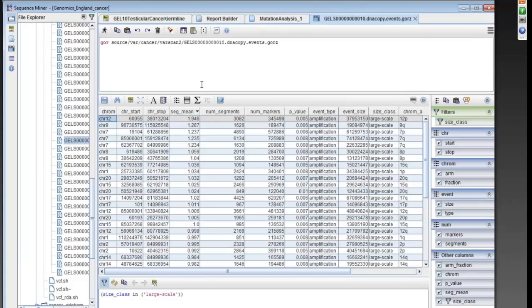Common NUT fusion is a NUT fusion with a bromodomain gene. In this case, we see a fusion between NUT and a kinase domain gene, CSNK1G3, which is a gene in the Wnt signaling pathway. So we see here a fusion between NUT and a Wnt signaling pathway gene, which might be interesting for this cancer. We reported that as well. Okay, that's what I had.